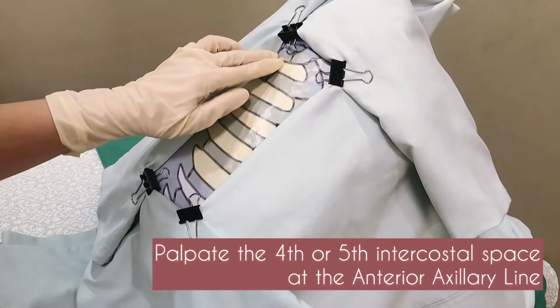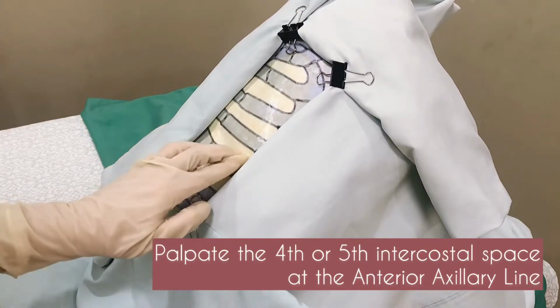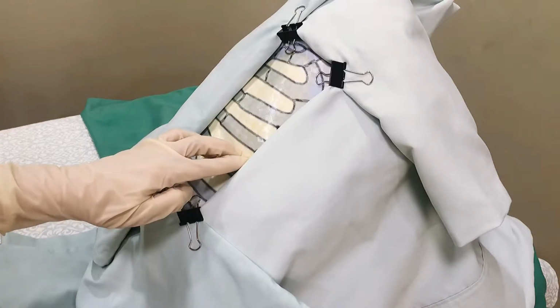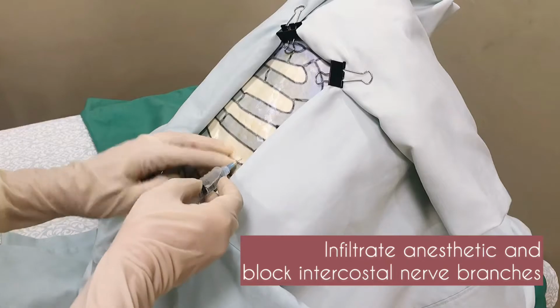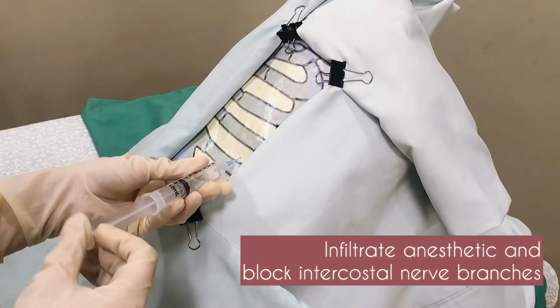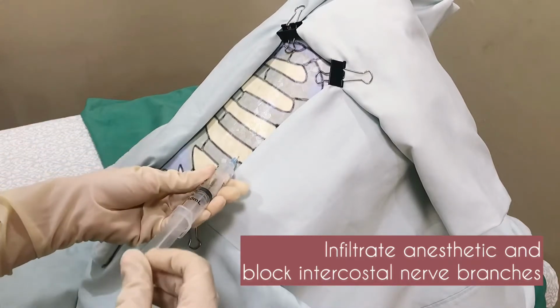Palpate for the 4th or 5th intercostal space at the anterior axillary line. Infiltrate the skin with a local anesthetic and block the intercostal nerve branches. Do not forget to infiltrate the pleura.